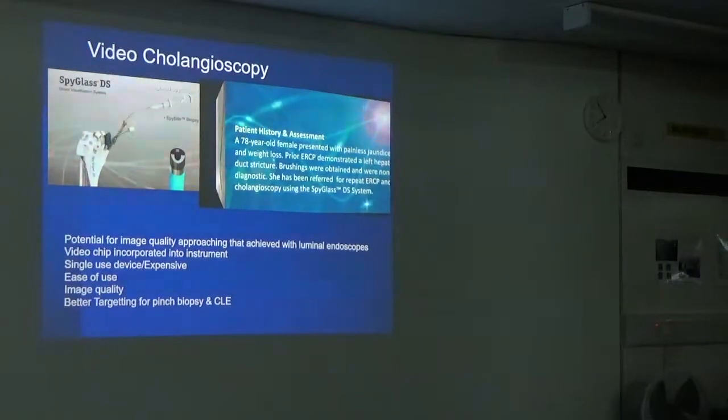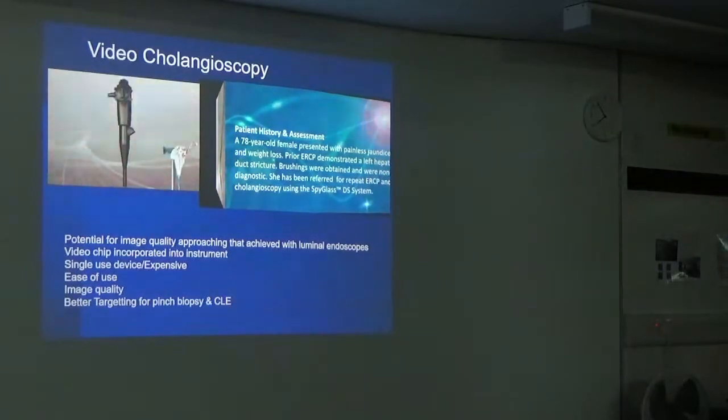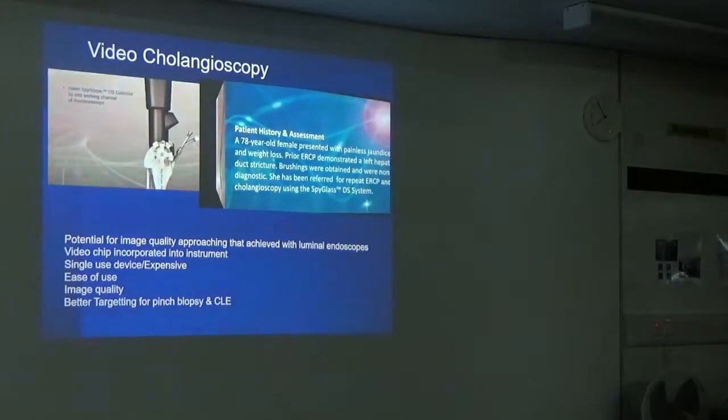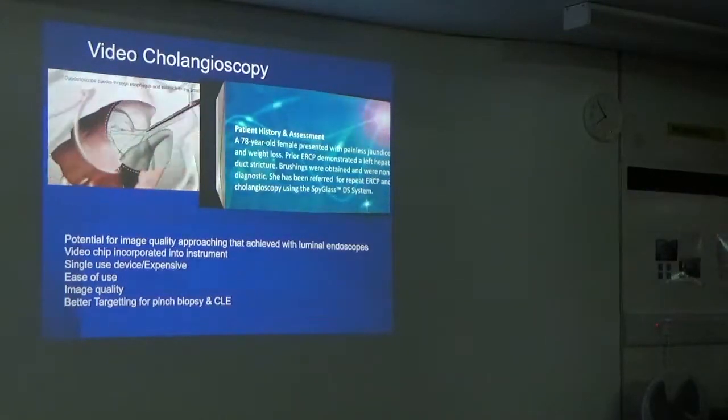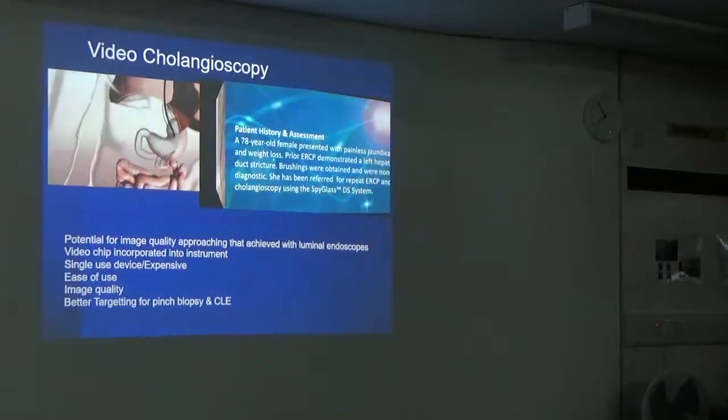So it's basically, you don't have to put a fibre optic down, it's a single use device that attaches onto the side of the main scope, and there's only a few units in the country using them. Certainly we're the only ones in the region with this instrument, and it allows us, as I'll show you, to do very detailed examinations in the bile duct, up into the liver even, that couldn't have been done previously.